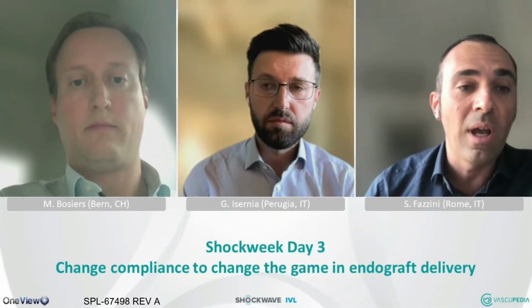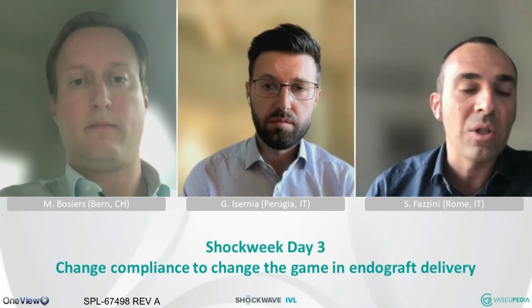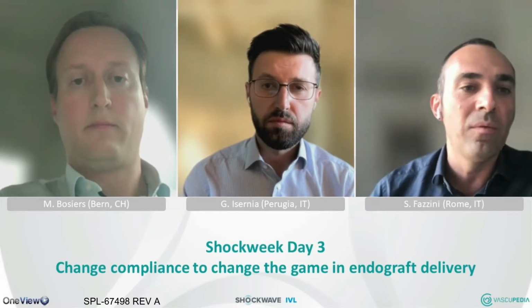So this technology really changed the game, because for large bore devices and very calcified access, you can change the compliance. And you showed us also with the second case how extremely changed the conformability of the calcium is still there, as you mentioned, but the luminal gain increased, the vessel compliance increased, because very smoothly you cross the lesion, you cross the calcium, and you delivered your endograft in a safe way. Congrats. Exactly. Thank you very much, Stefano.